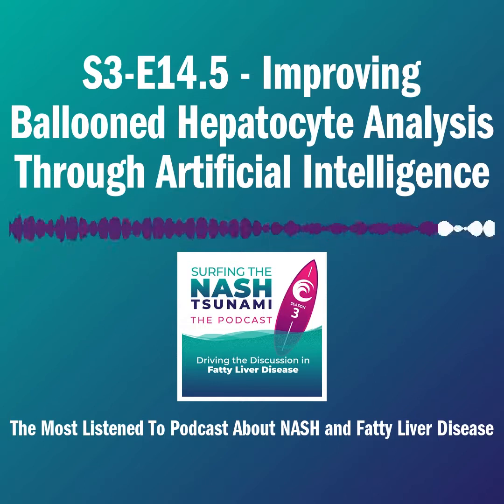And it's great from that point of view that within Litmus, Dean and the HistoIndex team are one of the partners in that consortium, working with Joern and myself and all the other partners, specifically so that we can start to do that and to improve our histological standard and therefore improve the reference point for the development and validation of non-invasive biomarkers. So as we fix the histology in terms of inter-observer variation, we're going to both help ourselves develop better trial endpoints and also help ourselves develop non-invasives that can support drug development in the future. So it's a double win, really.